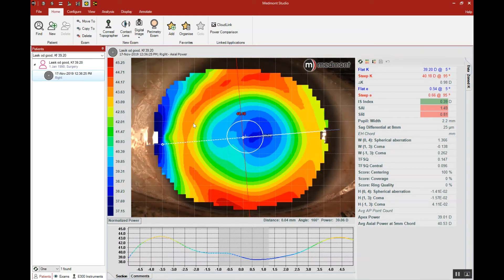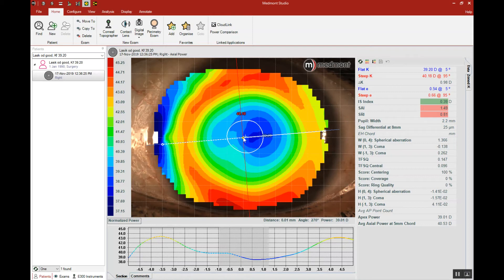Now let's look at our third case. Here we have a patient where things look different. Instead of the center being the steepest curvature, the center is near to the flattest curvature. Then the cornea steepens up in the mid-periphery before beginning to flatten out again toward the limbus. So this is your oblate surface — the cornea that's reverse geometry in shape. Instead of steepest in the center, we're flattest in the center; instead of flatter toward the mid-periphery, we're steeper toward the mid-periphery. In cases like this, we cannot use eccentricity to describe an oblate surface. E-value can only describe a prolate eye, a relatively normal eye, or an eye that has a high rate of flattening, such as a keratoconic, that goes from steepest in the center to flattest in the periphery.